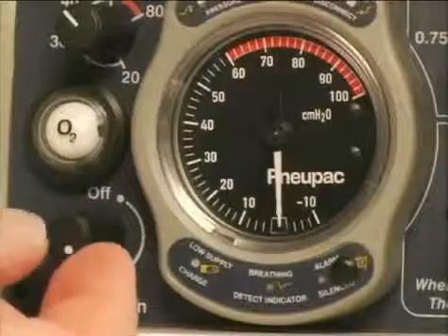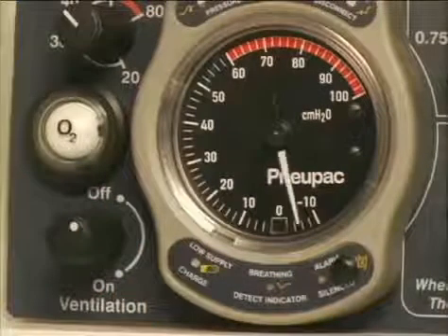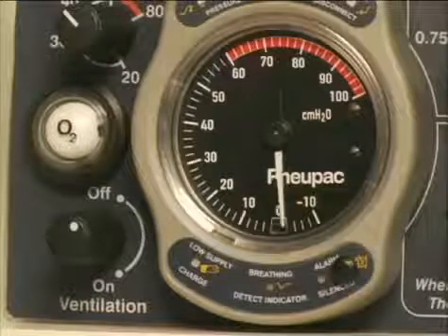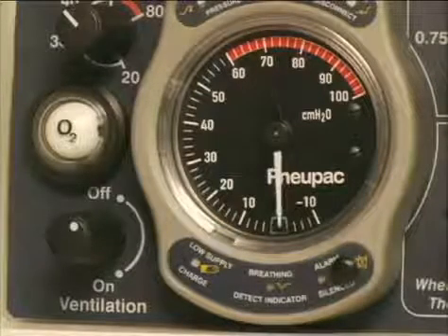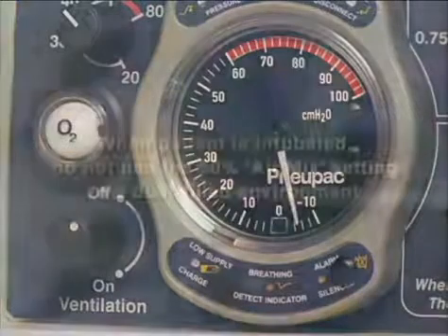Select the off mode if the patient is obviously breathing spontaneously and you're using the ventilator to provide 100% oxygen therapy, or for rescue from a contaminated atmosphere. In this mode, the patient receives 100% oxygen and the ventilator does not operate.